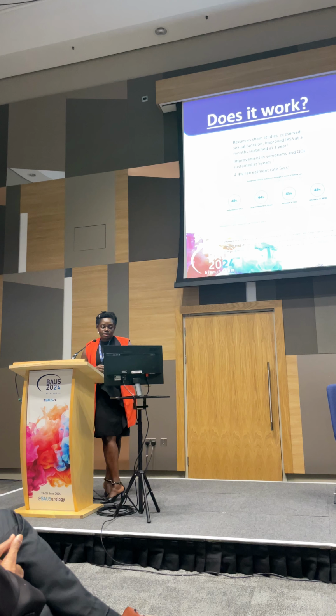Making the case for Rezum. What is Rezum? It's water vapor therapy. It involves the delivery of thermal energy via steam transurethrally directly into the prostate tissue.